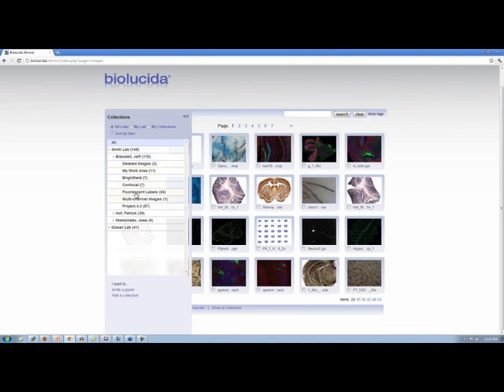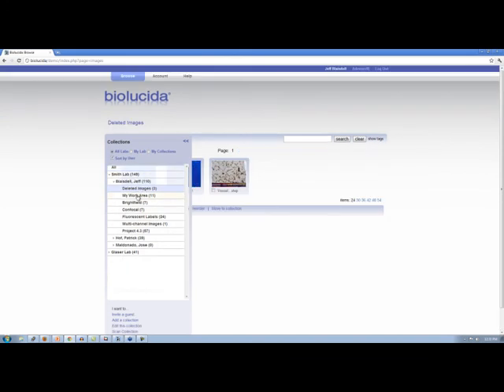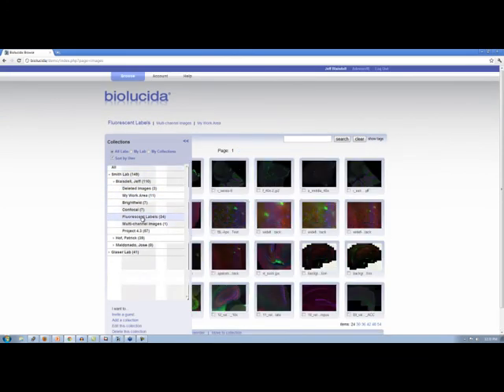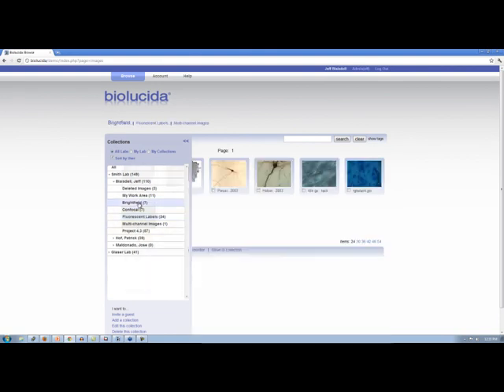Okay. Now I can click on each one of these, and as you see, the thumbnails that you see change. So by choosing these different collections, I'm changing the thumbnails that are displayed because I'm looking at different images. Yeah, when you click on that collection name, it makes that the active visible collection in your workspace. Exactly.